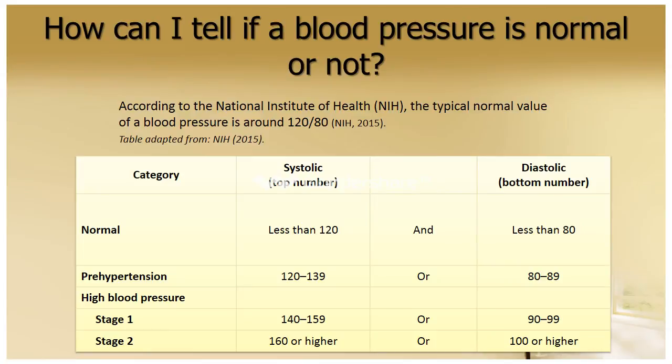You may not be able to do a whole lot about it, but it's good to be able to see from the most recent blood pressure that you took the differences in the two and say to the nurse, hey, this blood pressure is a lot higher or a lot lower than the last one we took. You might want to take a look at these. And again, it's important.